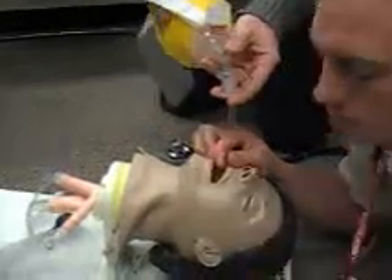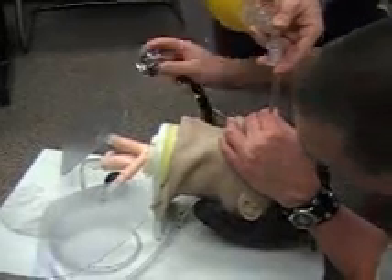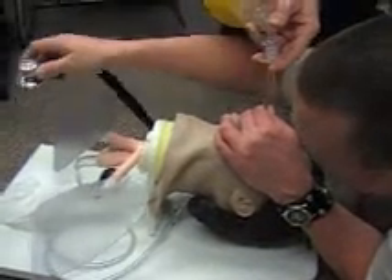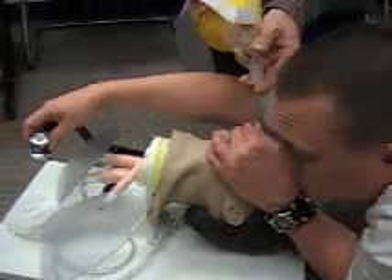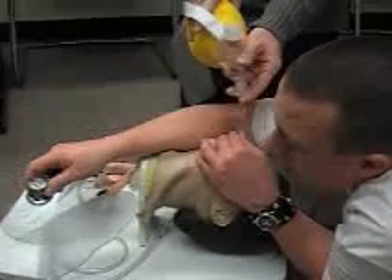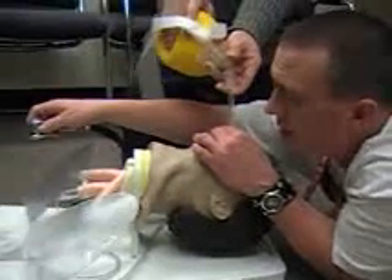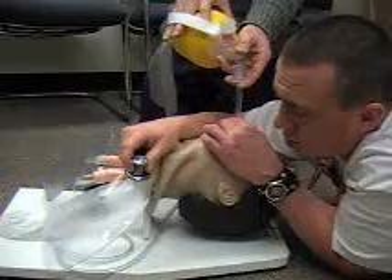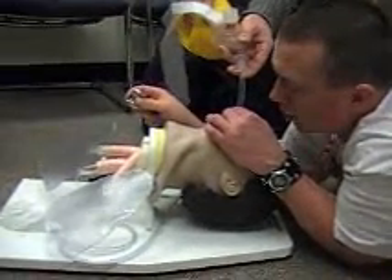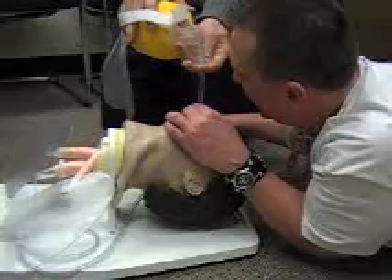I'm going to have my partner begin to oxygenate. I'm looking for compliance and equal chest rise. I'm going to listen and auscultate breath sounds, beginning with epigastric to make sure that stomach sounds are absent. I'm going to listen to the lower left lung — I expect to hear lung sounds and I do not. Lower right — I do hear lung sounds. Upper left — I do not hear lung sounds. Upper right — lung sounds are present. So I'm assuming that I have right mainstemmed.